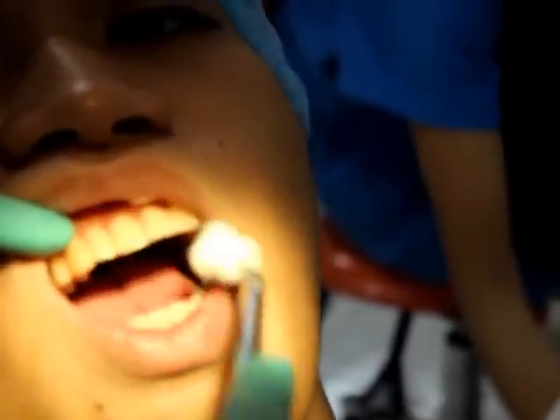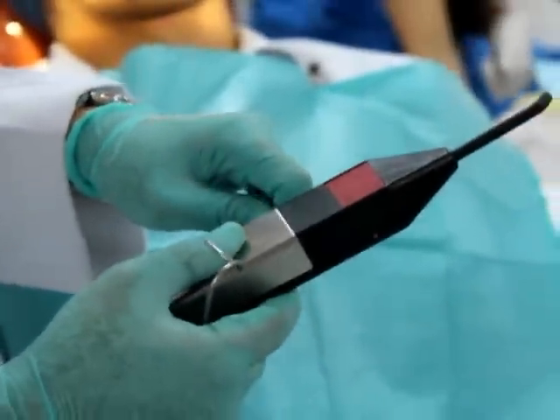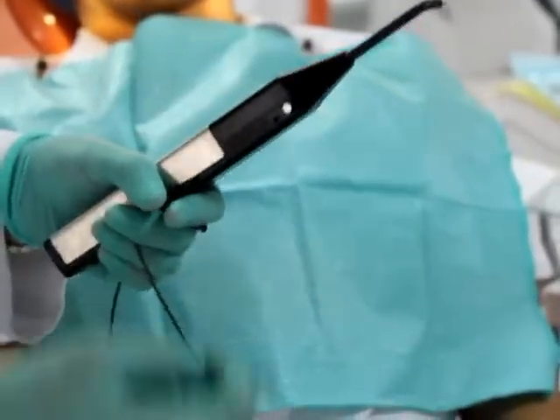So the next test is the EPT. What is the instruction for the EPT and how do you do it? Number 1, when this comes to you, it's separated.